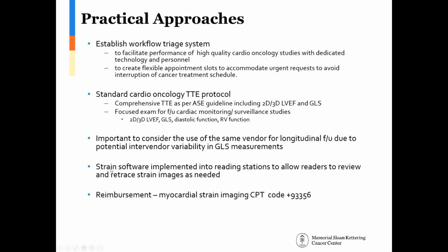And this I feel very strongly about. I know that in other labs this may not be as big of a problem, but I do feel very strongly that there should be strain software implemented into reading stations to allow readers to review and retrace strain images as needed. That is our policy in the lab: before we can sign off, the reader confirms the actual strain images. And then, when you're asking your administration for support, it's important to note that strain imaging is in fact being reimbursed by multiple insurances.